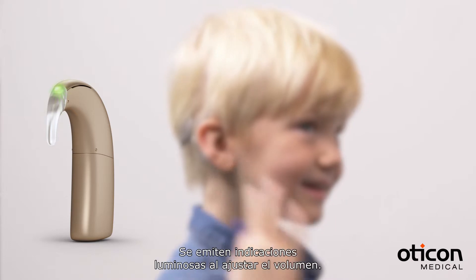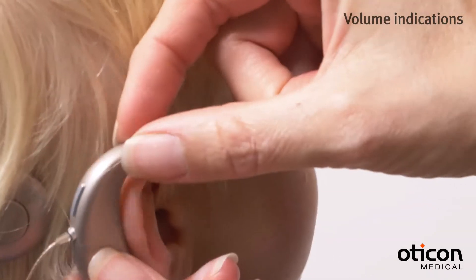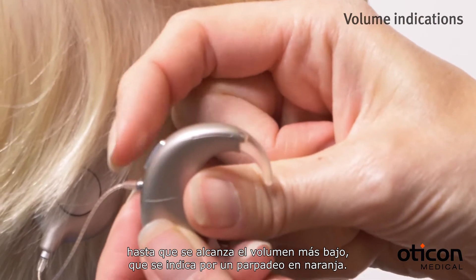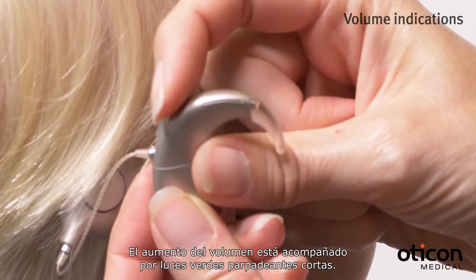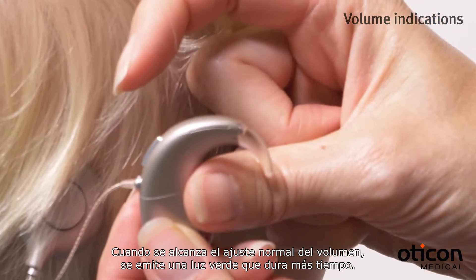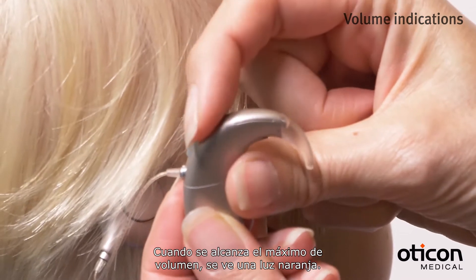Light indications are given when adjusting the volume. Reducing the volume is accompanied by short green blinks until the lowest volume has been reached, which is indicated by an orange blink. Increasing the volume is accompanied by short green blinks. When the normal volume setting has been reached, you see a longer green light. When you reach maximum volume, you see an orange light.